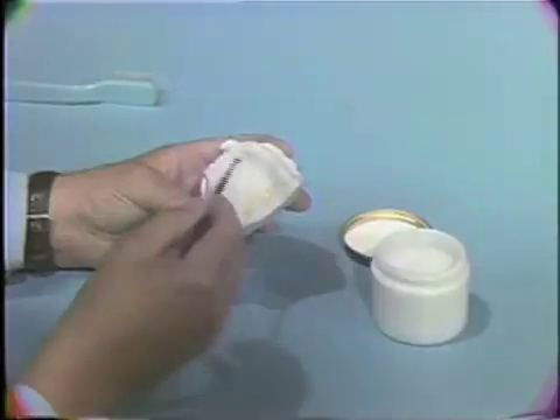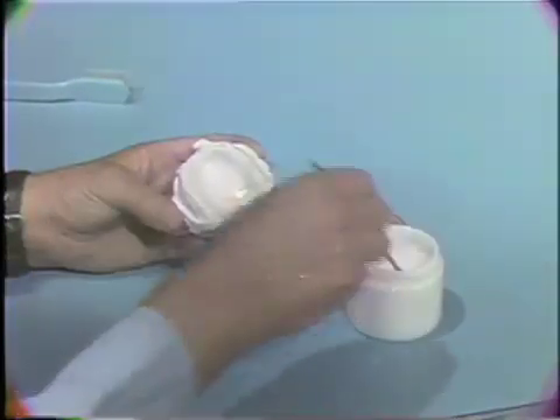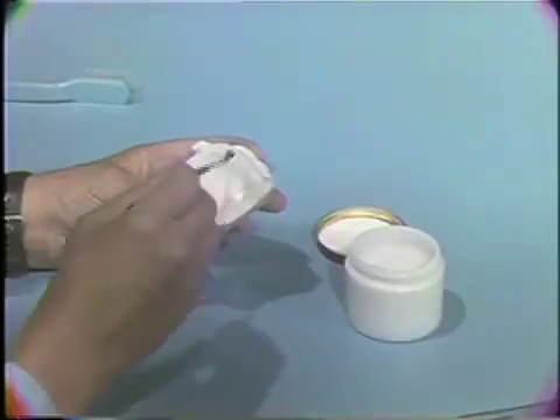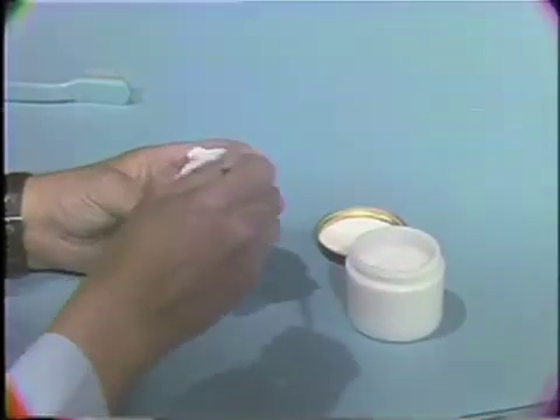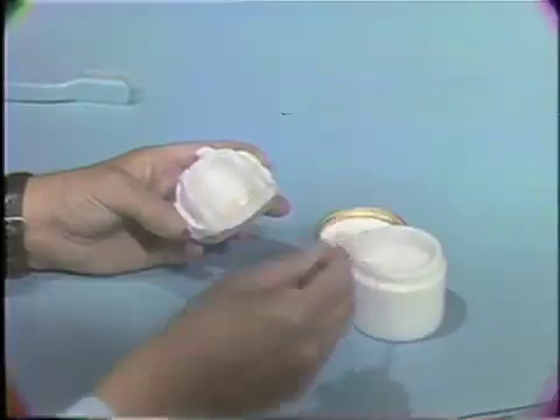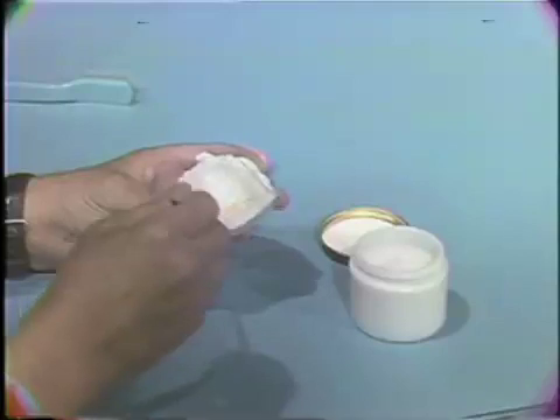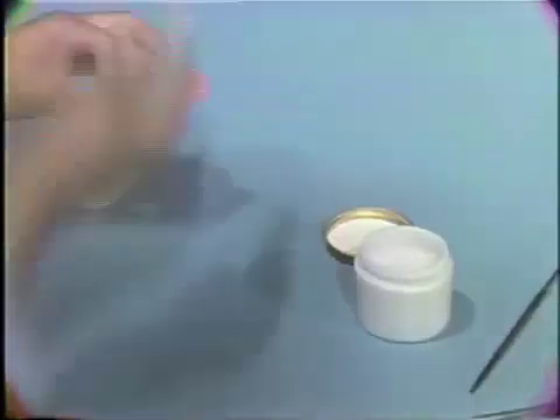Paint tinfoil substitute over the entire surface of the impression plaster cast. Next, cleanse the maxillary denture of all debris.